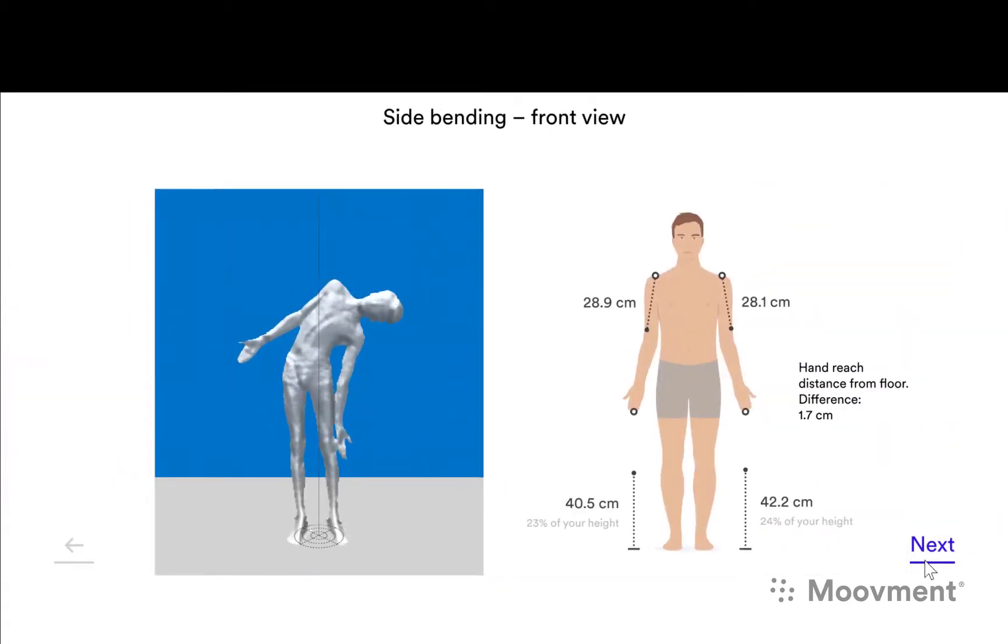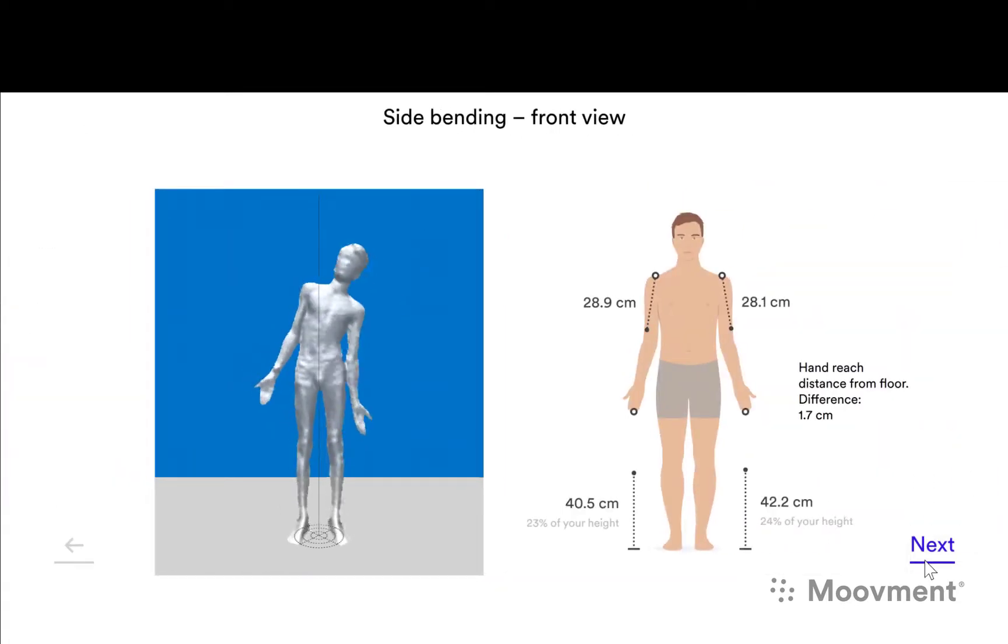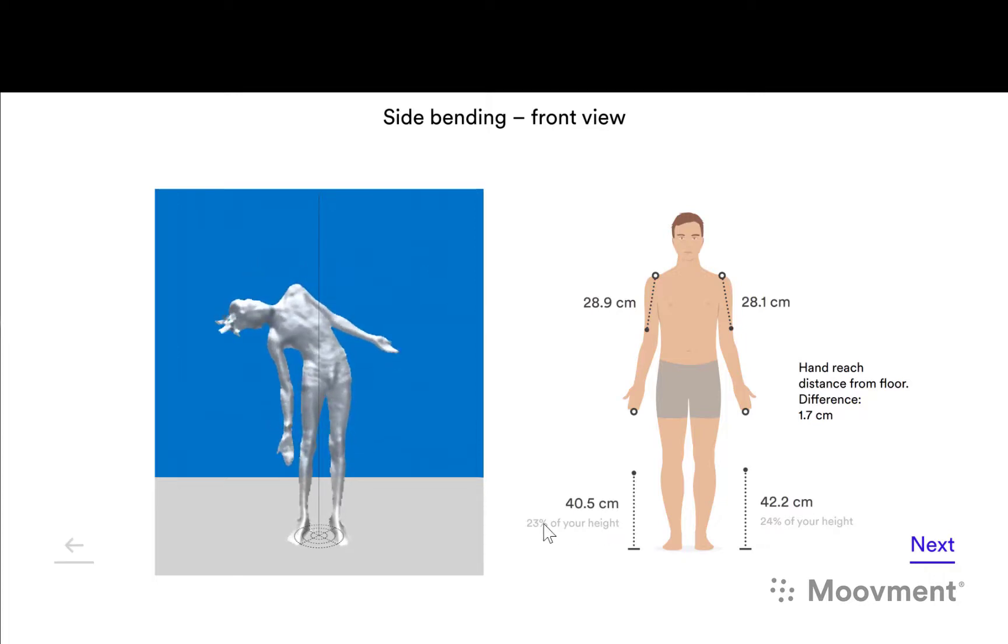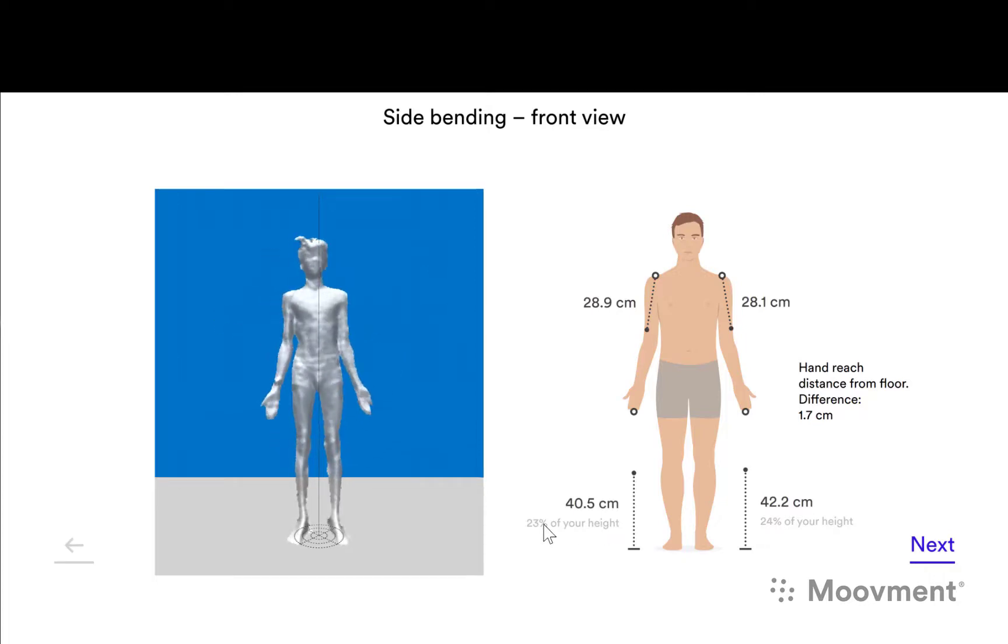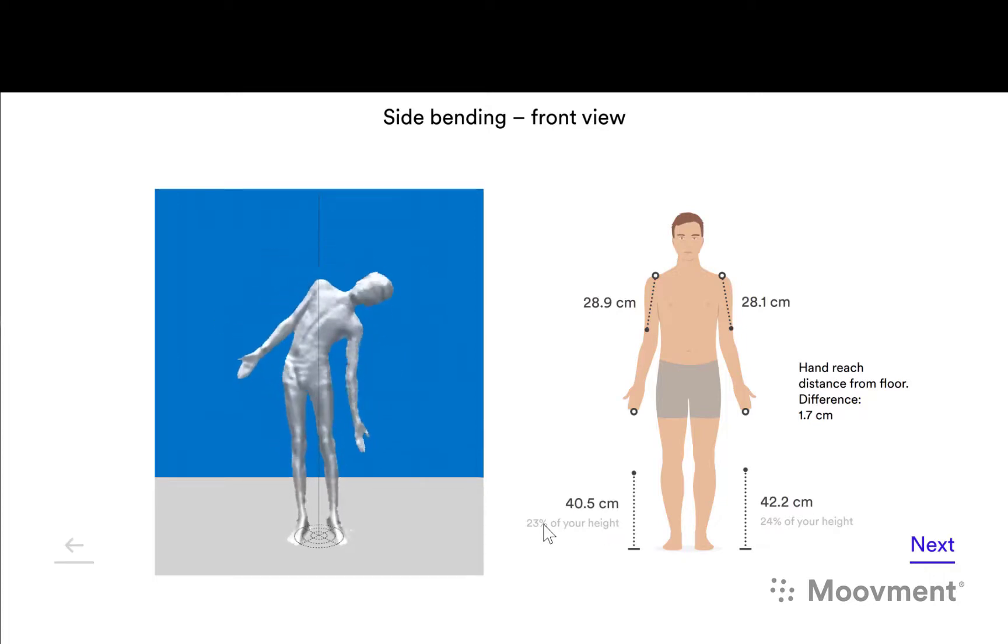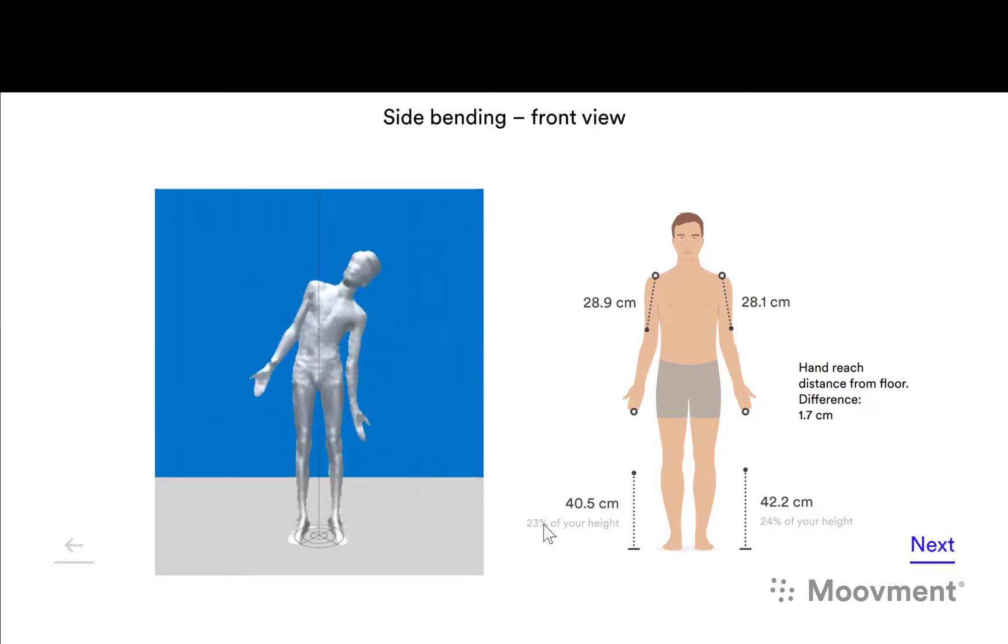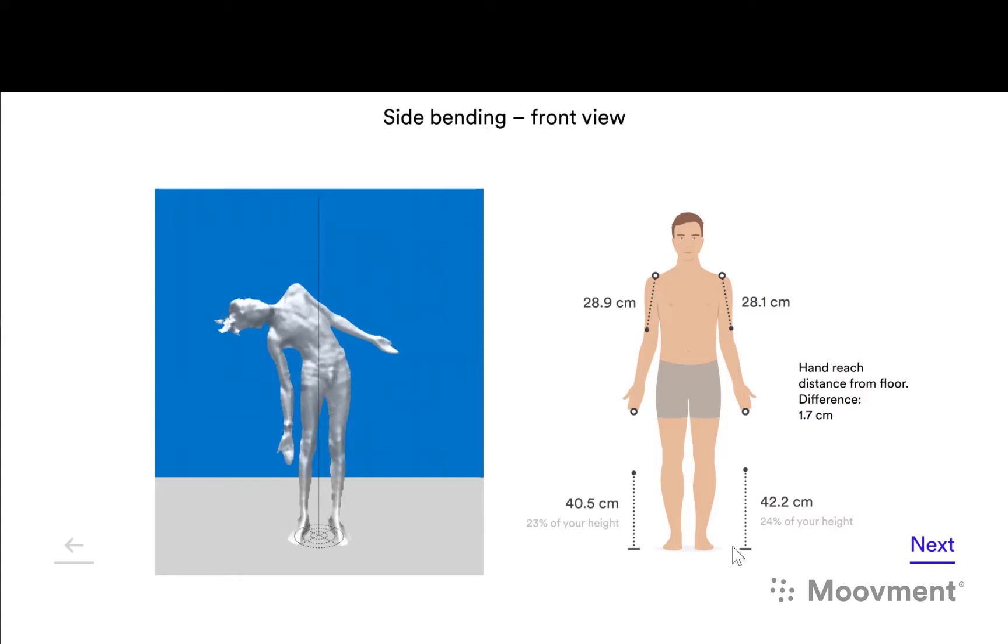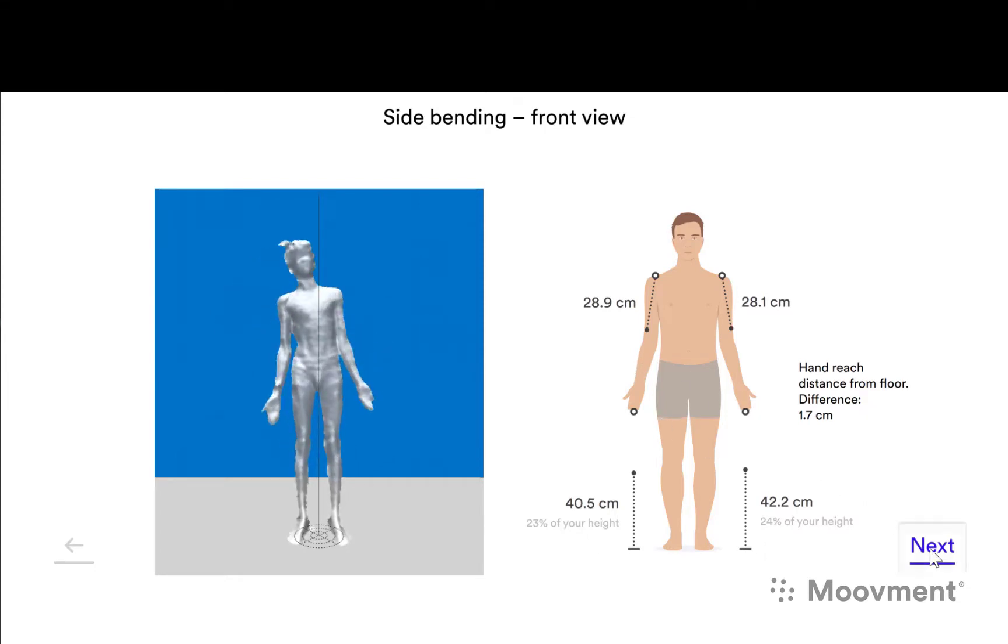Side bending is quite symmetrical left and right, and the distance is very good. He goes to 23% of his height. Normally we have a cutoff point for northern Europeans at 30%, and in this case he's well and truly under 30%, so you can see he's quite flexible and very symmetrical.